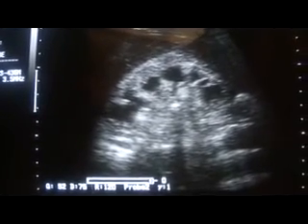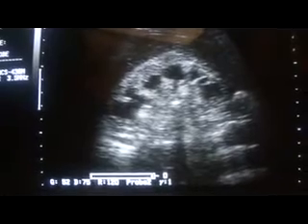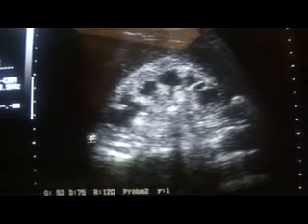Now this video segment relates to post-surgical complication. This young gentleman had a renal stone removed by surgical intervention, and presently you can see that the kidney is measuring 9.1 centimeter in length and 4.5 centimeter in anterior-posterior diameter, which is within normal.